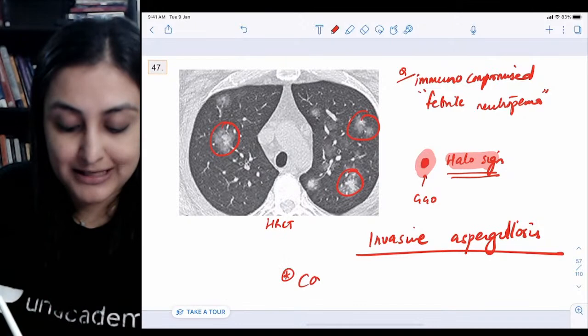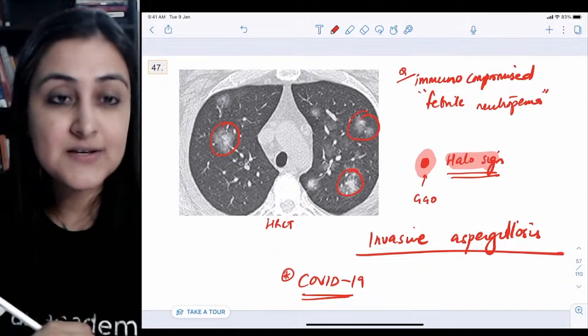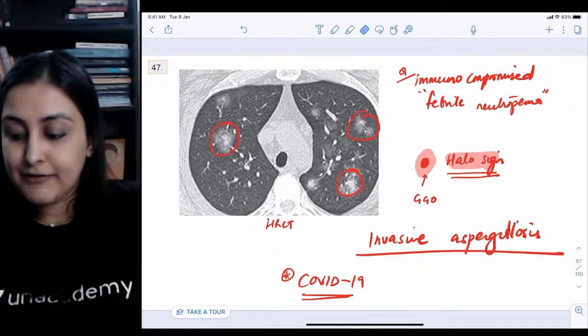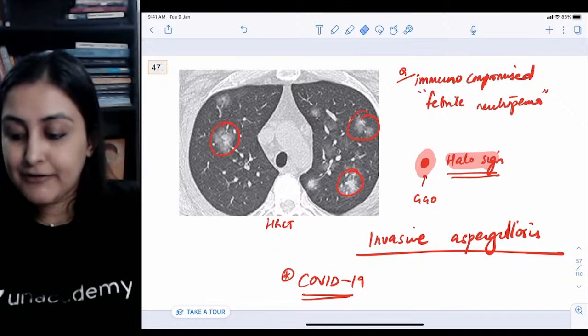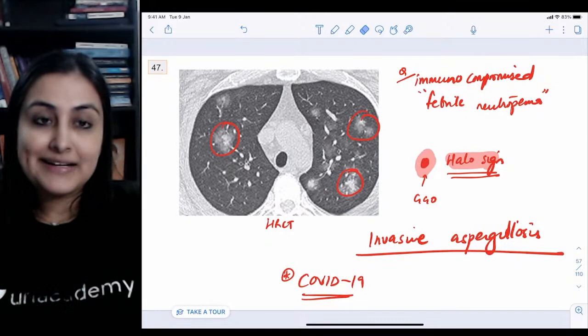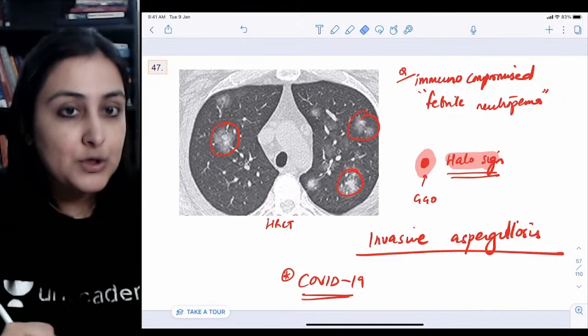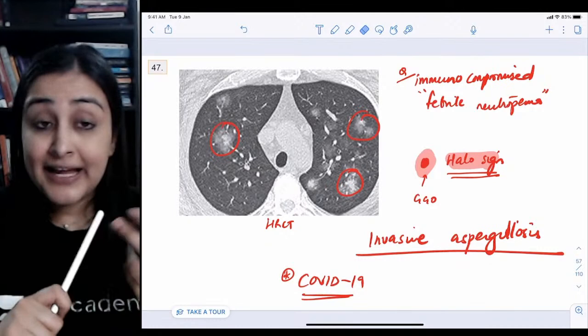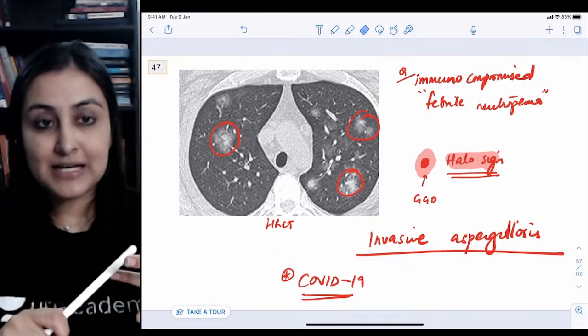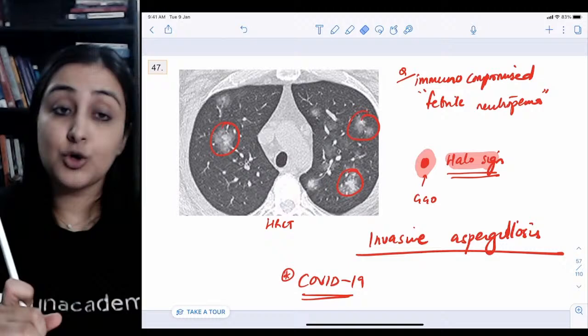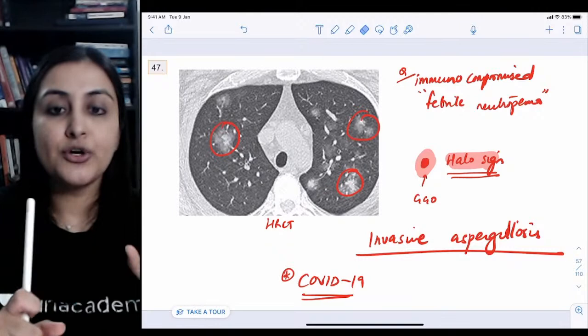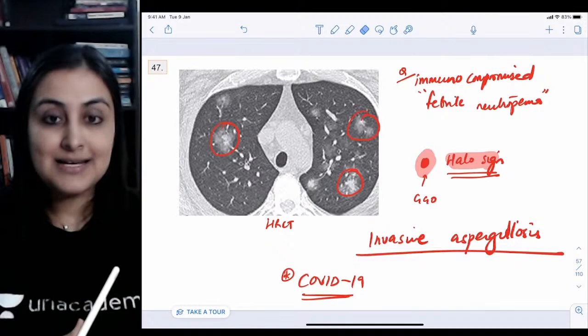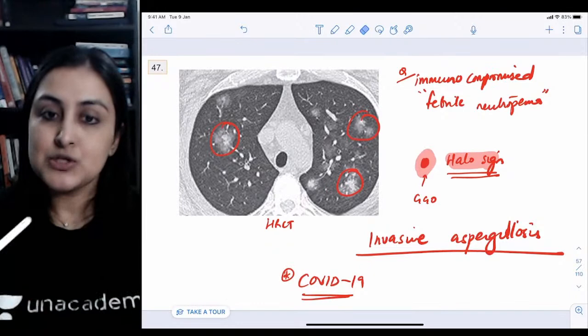COVID-19 can also produce a halo sign — it has a variety of manifestations. However, COVID-19 does not produce the changes seen in TB: tree-in-bud, necrotic lymph nodes, pleural effusion, or cavitation. Fibrosis may overlap, but otherwise TB findings do not overlap with COVID-19. GGO means ground-glass opacity.